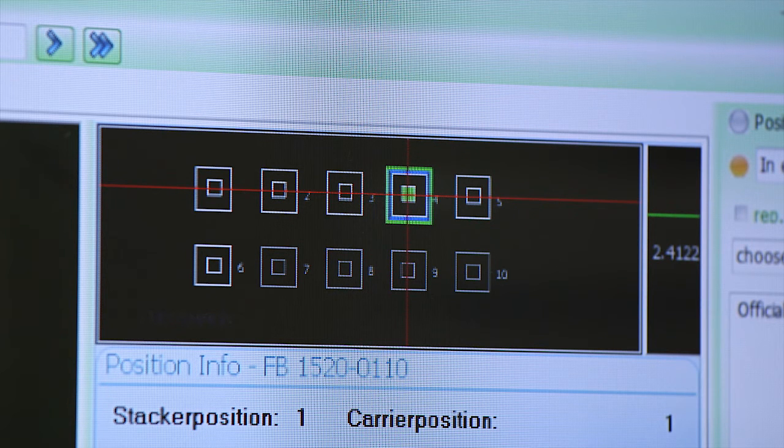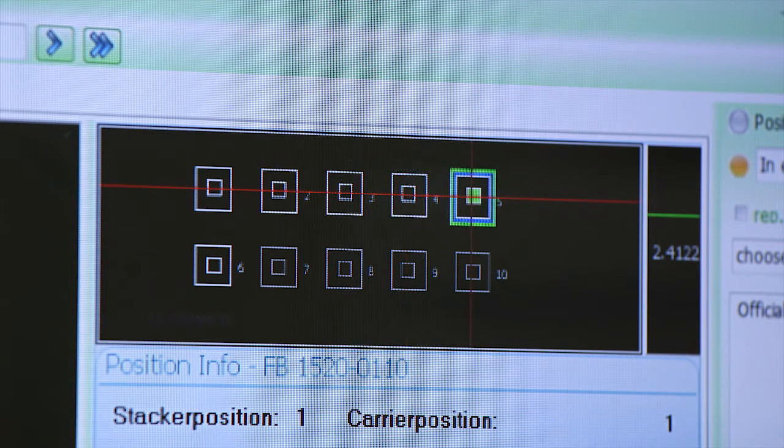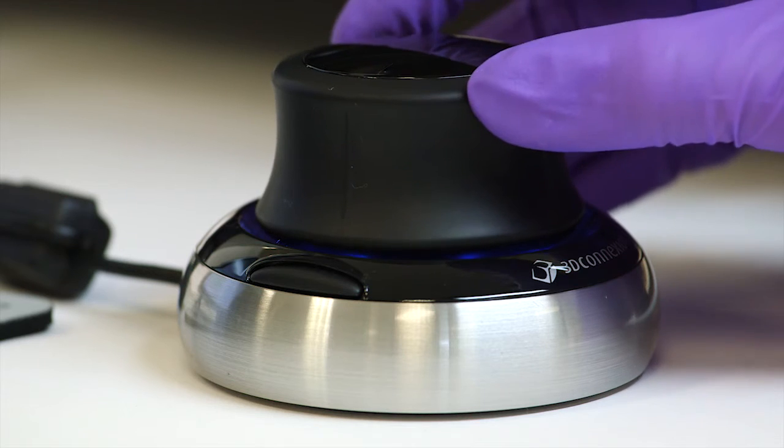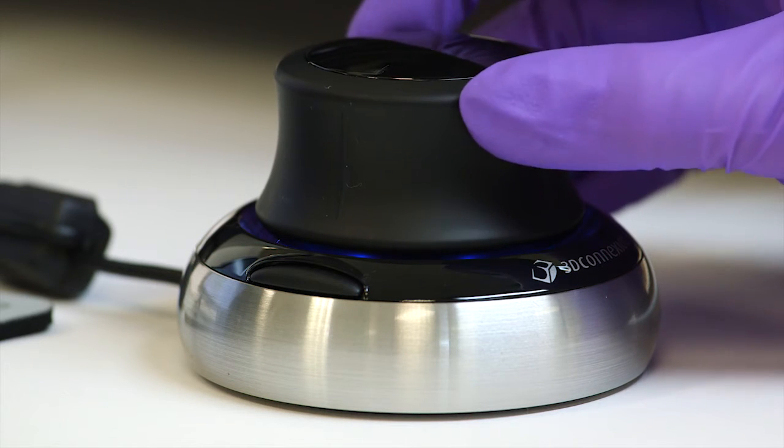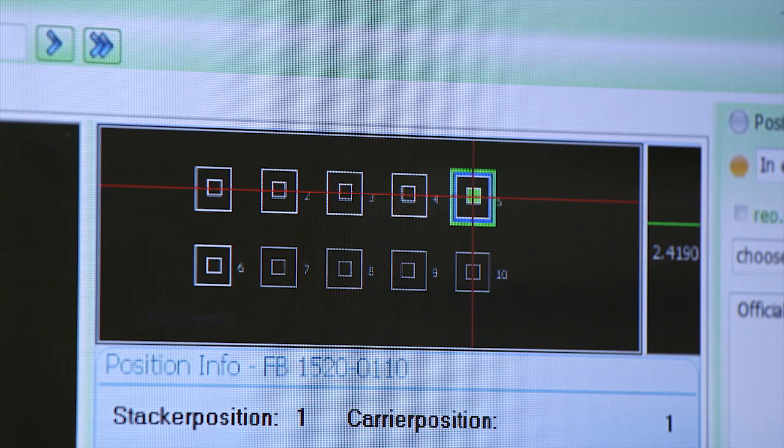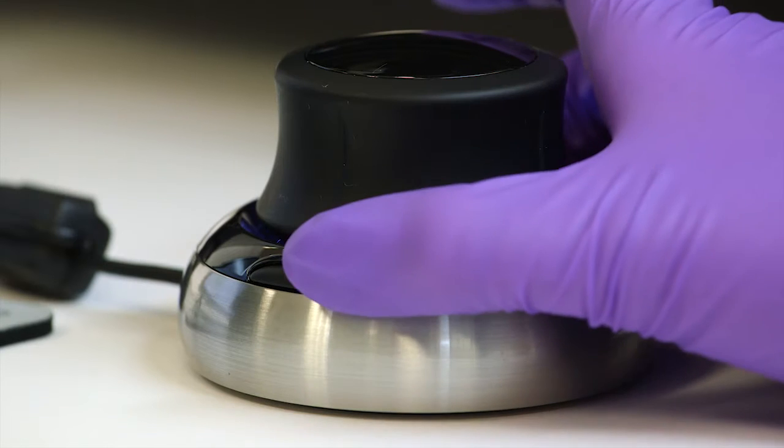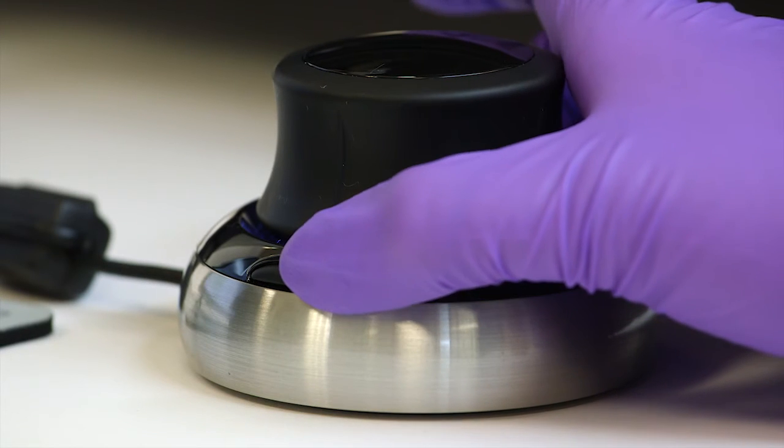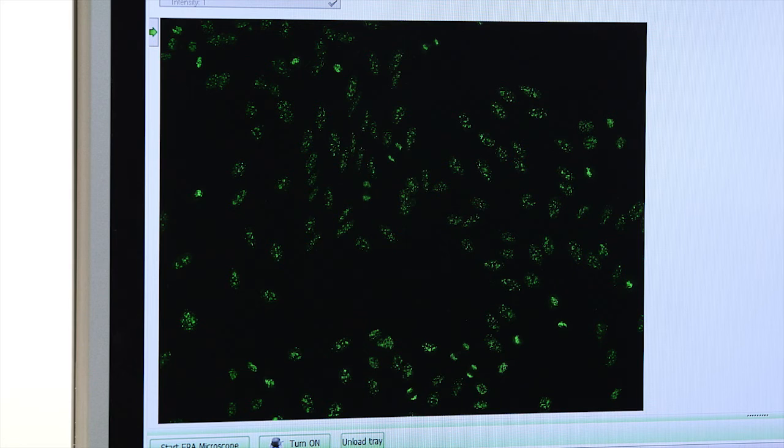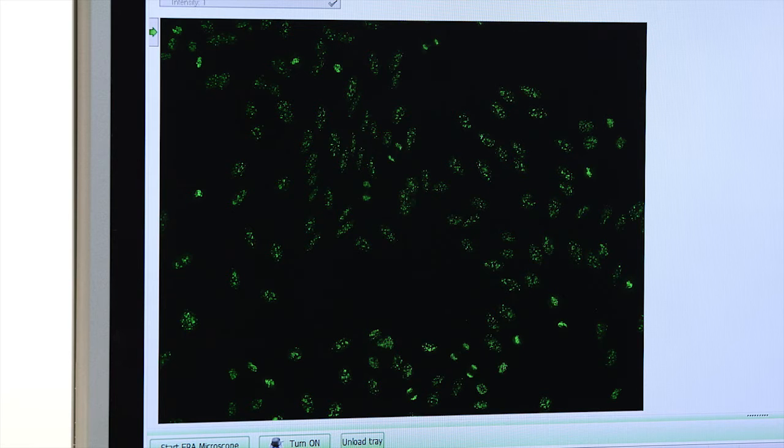If additional images are required, fluorescence images can be recorded manually using the 3D mouse. When the desired image section is selected, press Enter to capture the image. The photograph is captured, saved and forwarded to Europattern for pattern recognition.